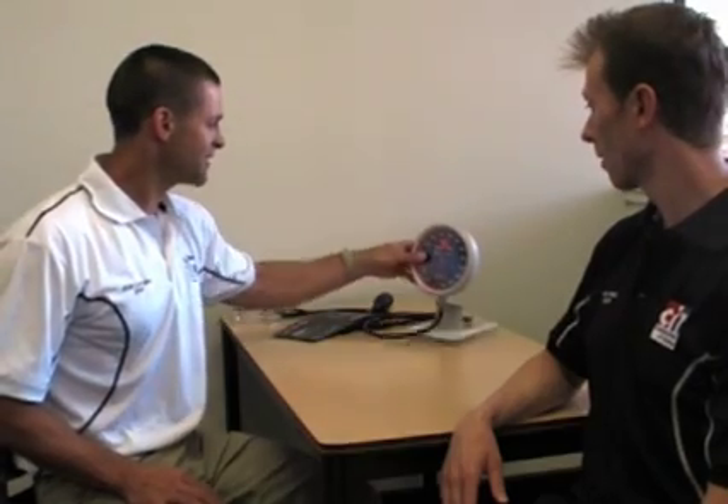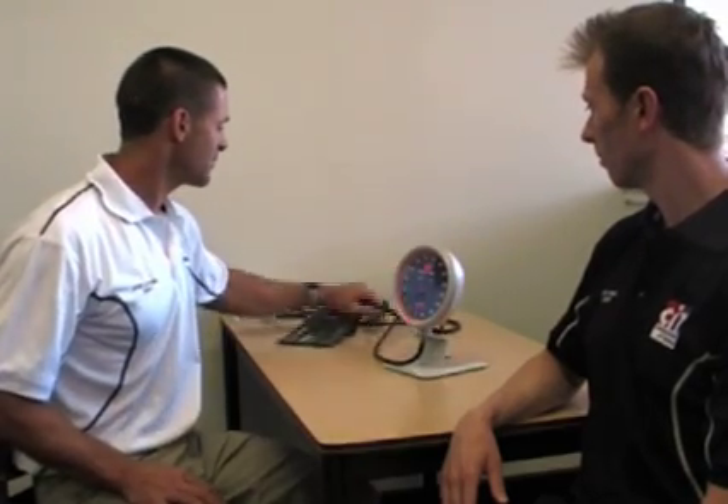Taking blood pressure is a skill that takes a lot of practice and time, so it's important that you practice it as much as you can. There are two pieces of equipment we use. The first is a sphygmomanometer. This is an easy sphygmomanometer to use because it has a large dial that makes it very easy to measure blood pressure. There are different types used, and this one is used in an educational environment to help students learn.